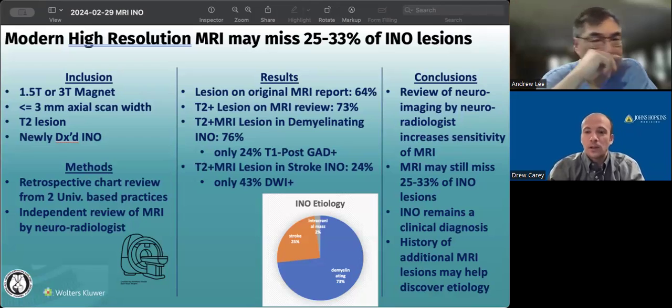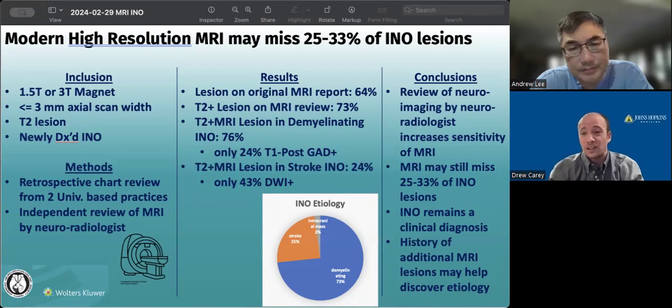And it may not be quite as good in the brainstem because when you get to tissue interfaces, there's a lot of distortion. Like it's really hard to see that in an ischemic optic nerve injury. And it's a small area and it's surrounded by cerebrospinal fluid, and then you have the aqueduct there, so you can get a lot of artifacts.